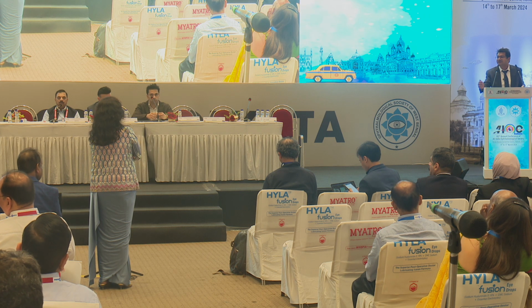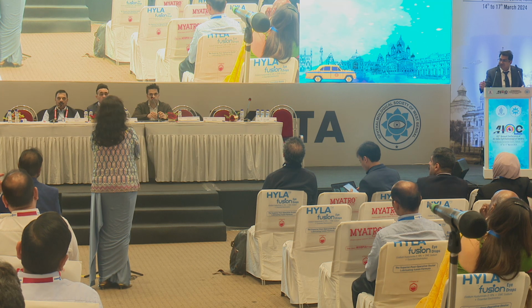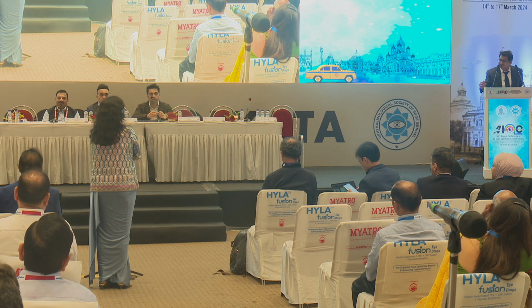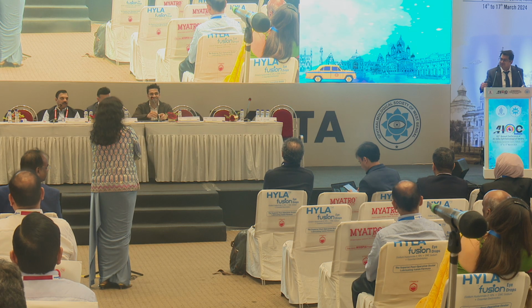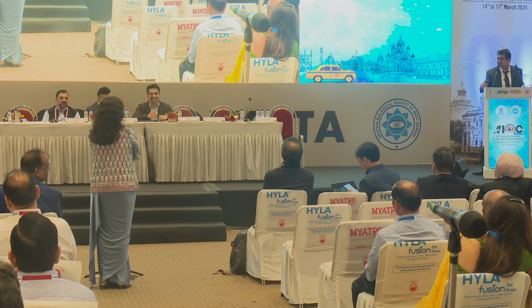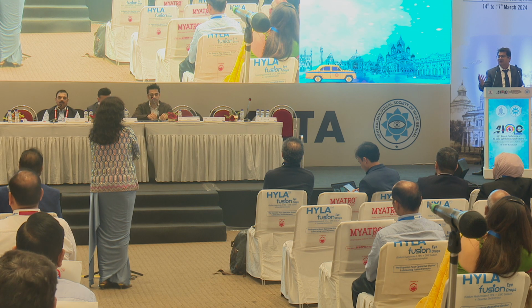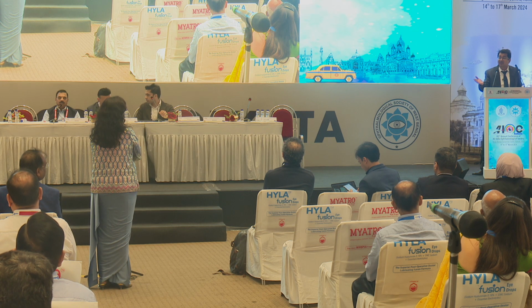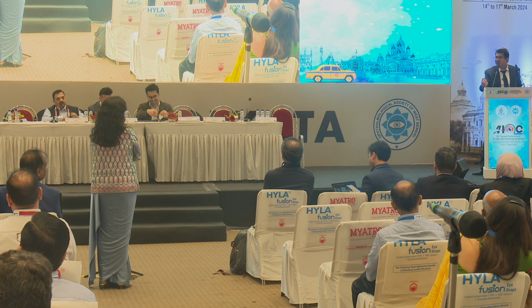So exactly that is my point. Silk has been launched recently, and we are all gaga for Silk, that Silk is doing very well. Because when Contura was launched, it was the same thing, that Contura is the best possible treatment. And now on this platform, we are discussing that Contura is beneficial only for 5 to 10% of patients. If the other 90% of the patients are getting the same vision quality with Contura or Silk, then why unnecessarily create a flap on the eyes?